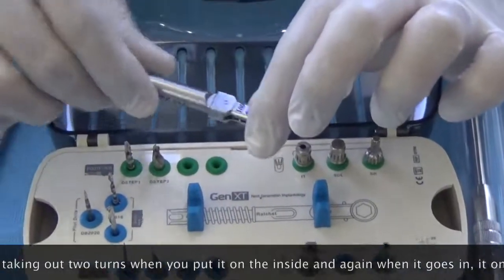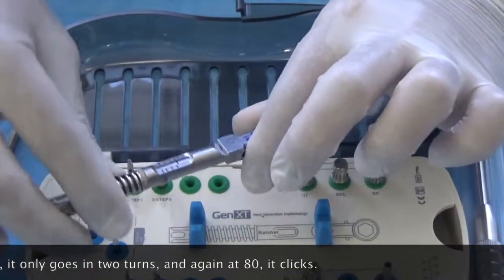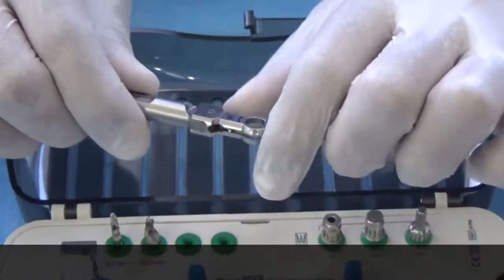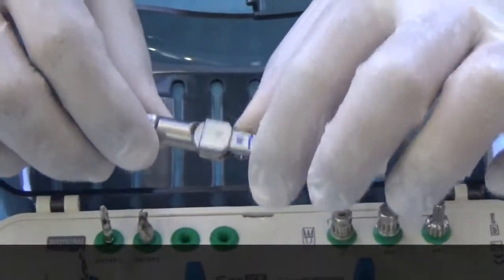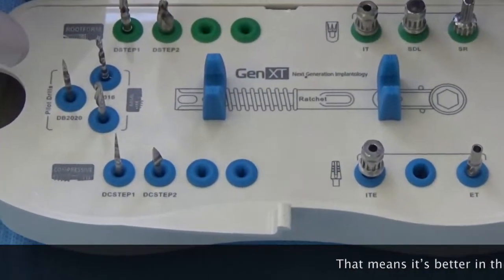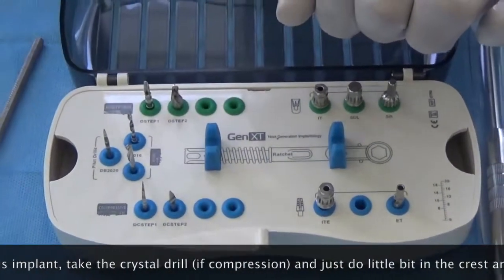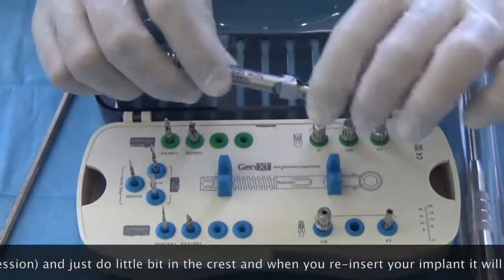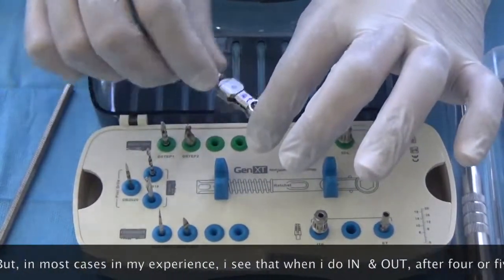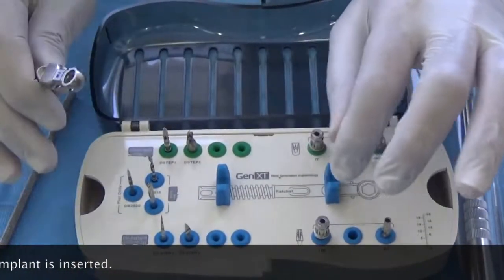Should you have a situation where after taking out two turns, when you put it on 'IN' the implant only goes in two turns and again clicks at 80, then it is better to remove the implant, take the crestal drill, and do a little bit in the crest. When you reinsert, the implant will go in much easier. But in most cases, in my experience, doing in-and-out in-and-out after four or five times the entire implant is fully inserted.